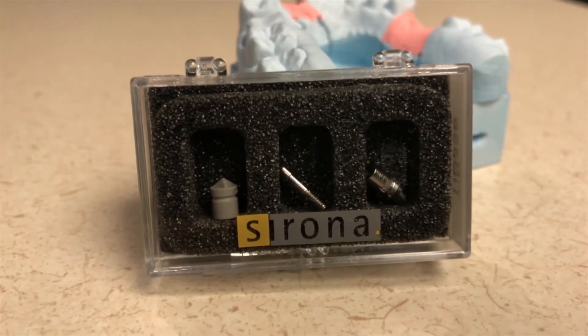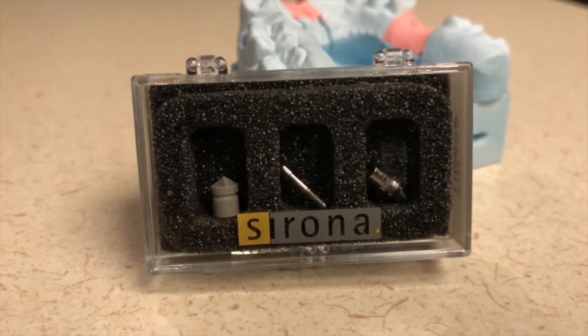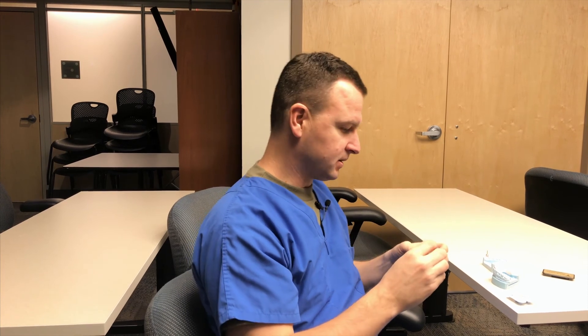They used to also include the scan bodies that went with the tie-based. For some reason the manufacturer no longer supplies that, so you're going to have to get a bulk order of scan bodies. They're basically a one-time use if you use them intraorally. If you use them in the lab, we can go ahead and reuse them without a problem. But since we didn't have one, we had to go borrow one from the lab. So I'm going to show you how to place that on the cast for the scan.